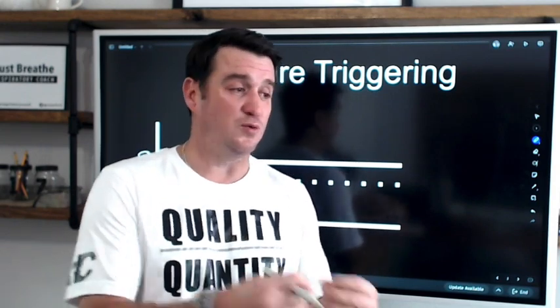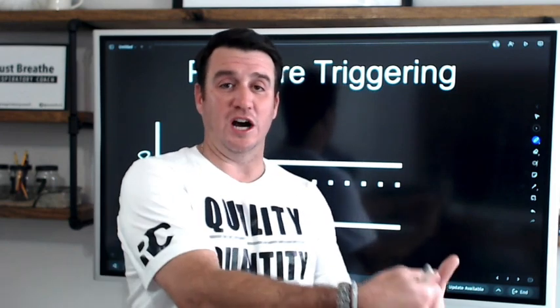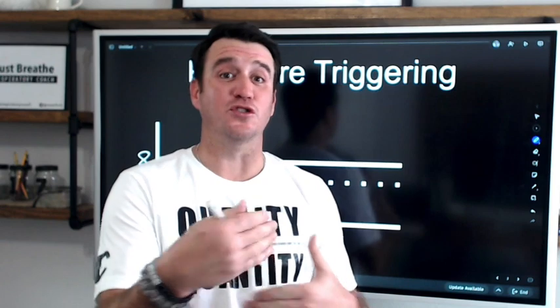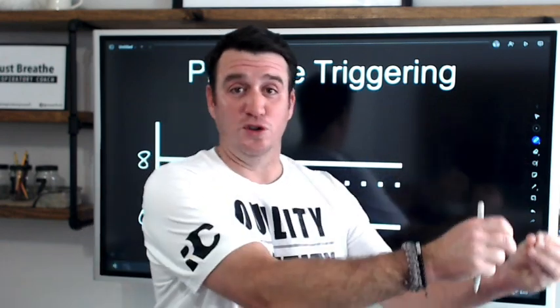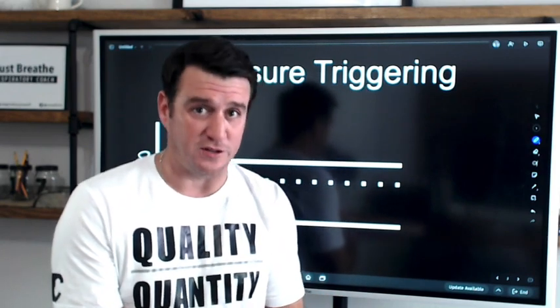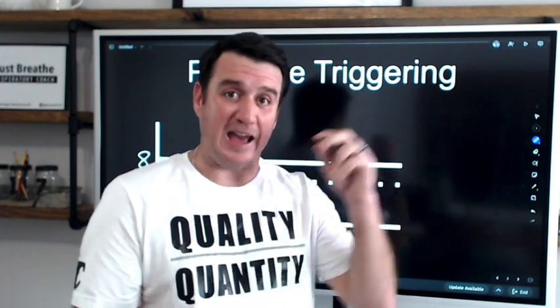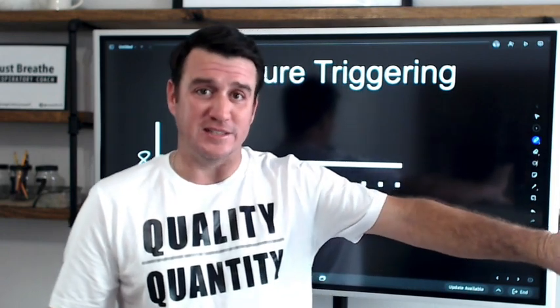The same thing happens when you're on mechanical ventilation. As the diaphragm drops, it will cause a drop in pressure intrathoracically, which will then be transposed to the ventilator circuitry, and there will be a noticeable drop in pressure. If that drop in pressure is great enough, then the ventilator will recognize it as an inspiratory effort and will deliver whatever the said breath is stated to be given.